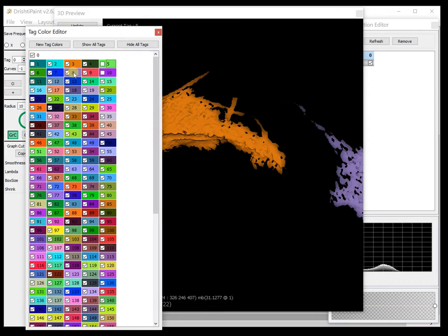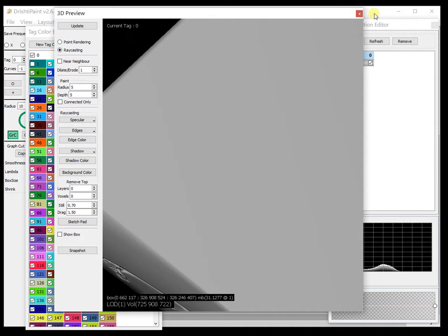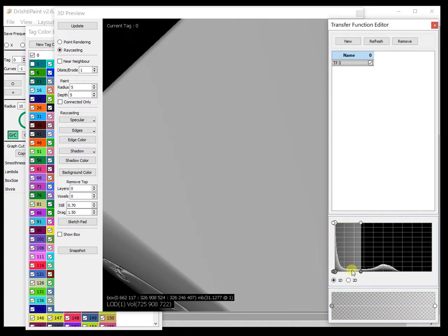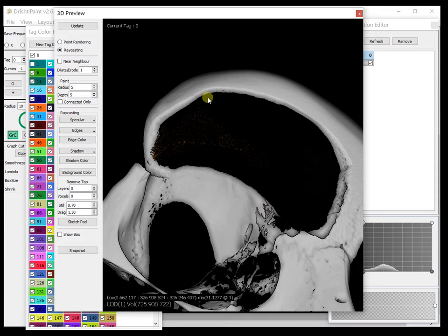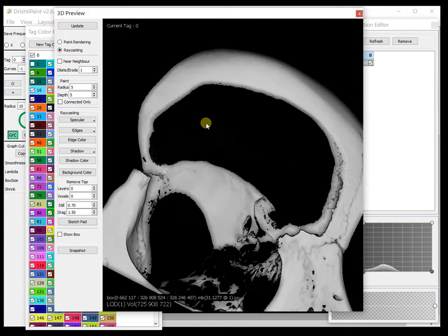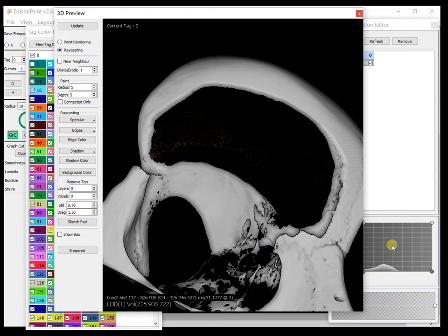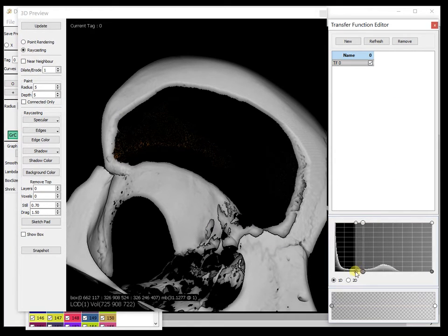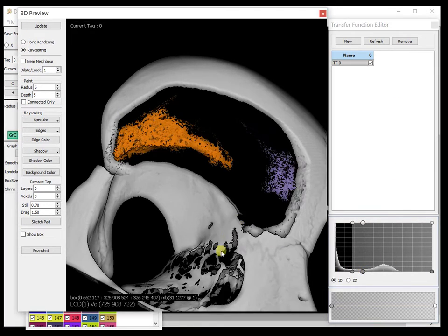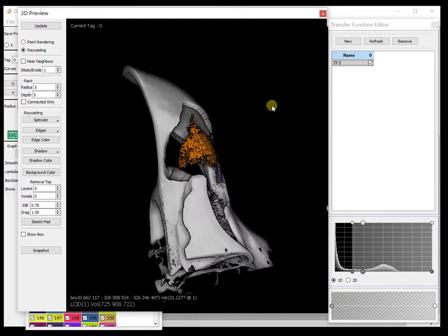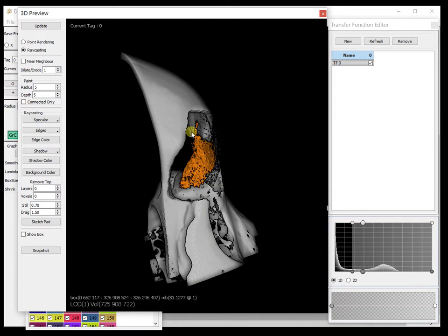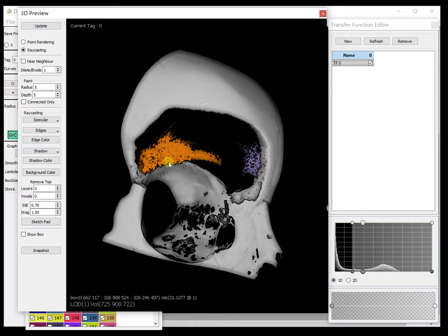And if you look at tag zero, so this is the part that we extracted. And I will just show you the bits. And this is what we have in the orbital bone.